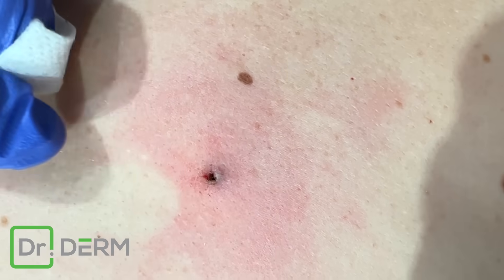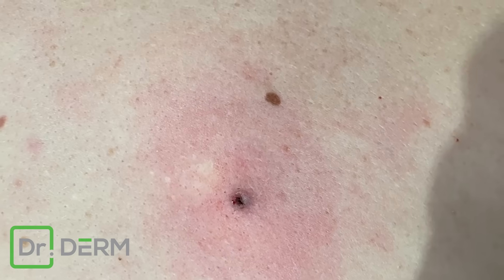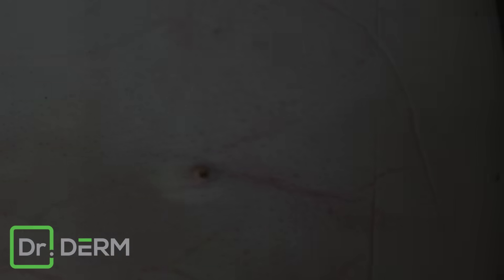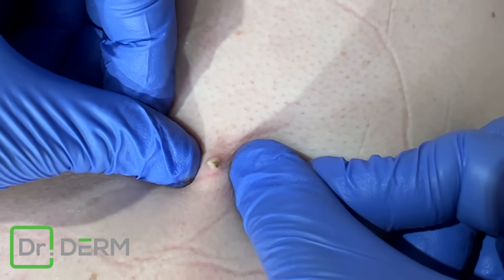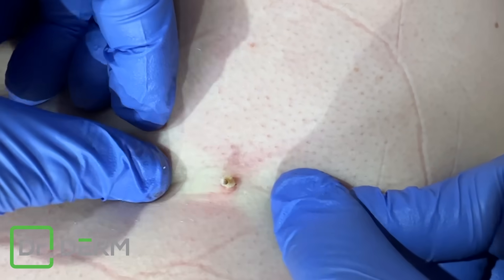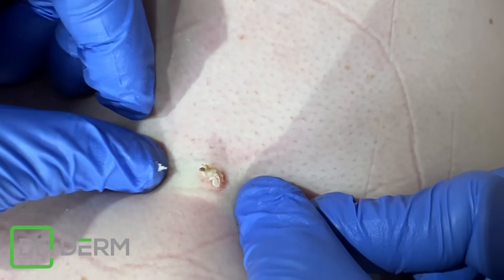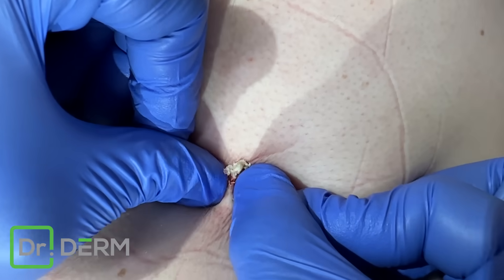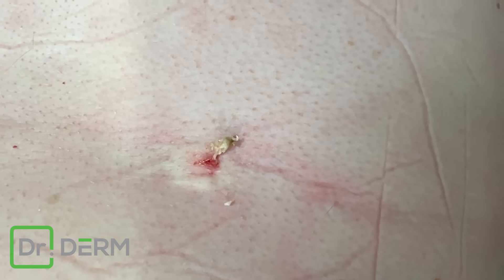I think that's the trick — you get the cyst out, you use a little heat, and that thing kind of scars up and virtually disappears. So if we just get that out like that — boom. Man, you sure can make good little cysts. We got that there.